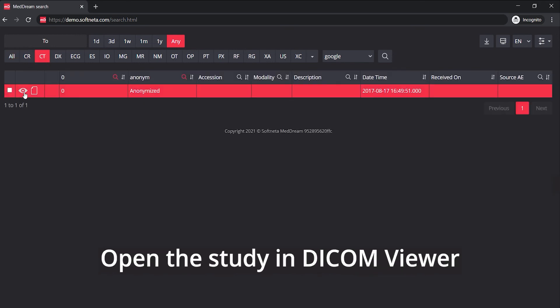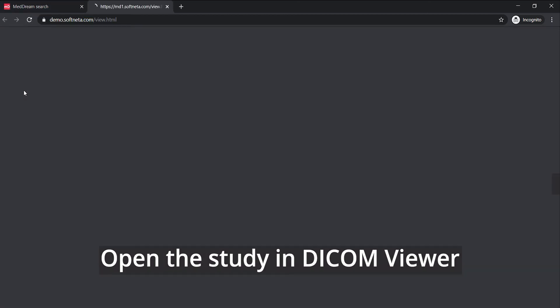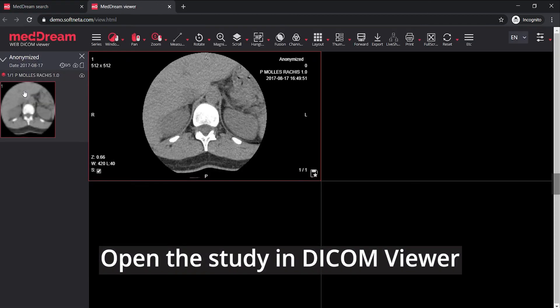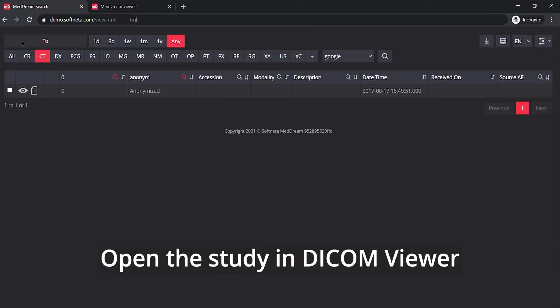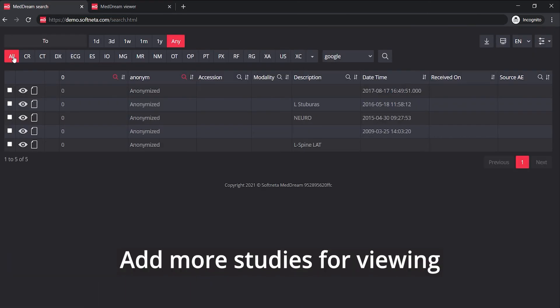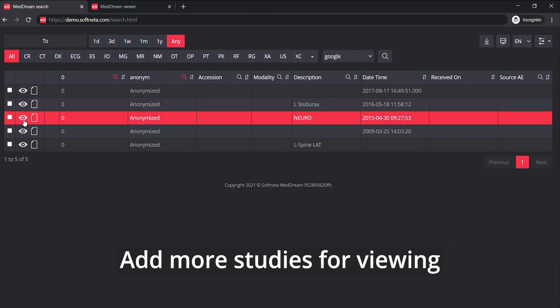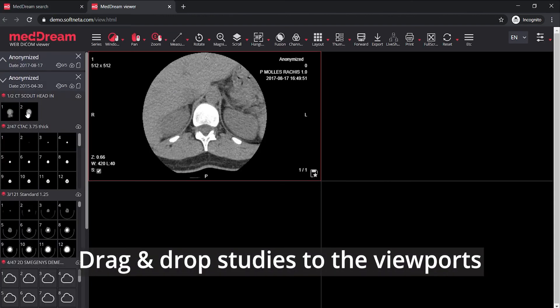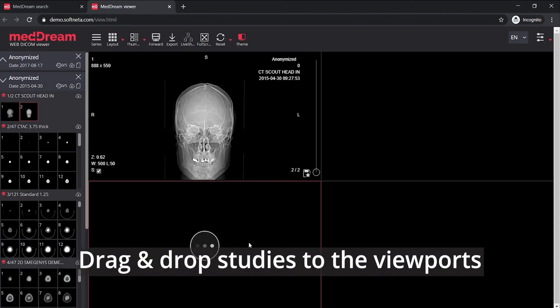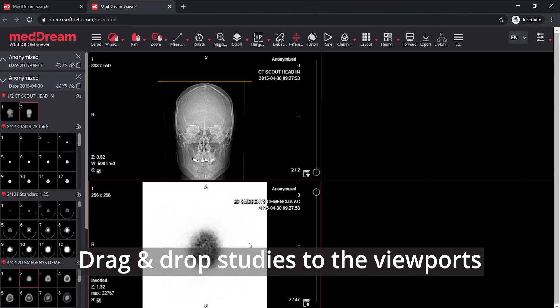Open the study in the DICOM viewer. Add more studies for viewing, and drag and drop studies to the viewports.